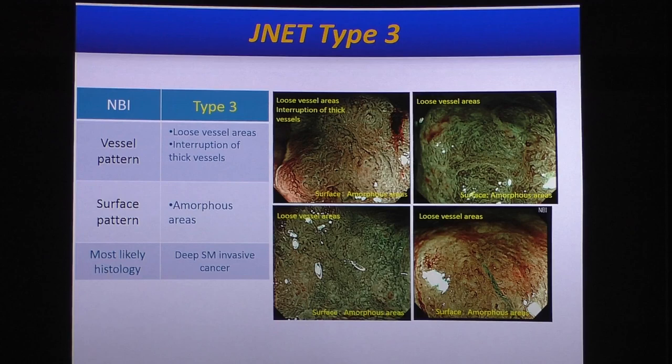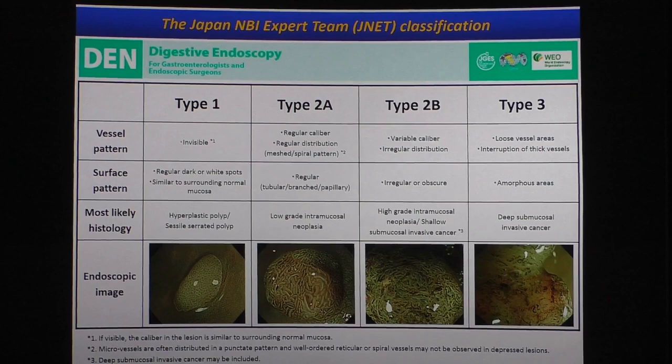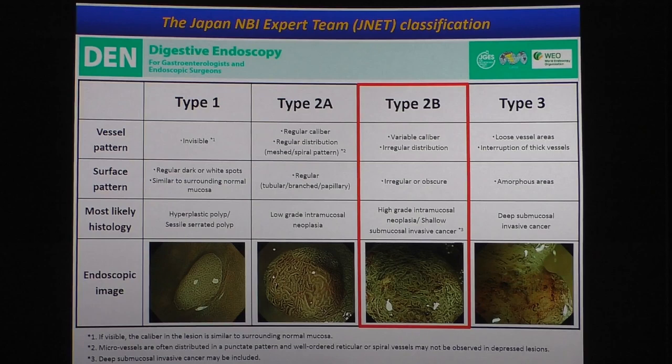Let me summarize the JNET classification. Type 1 is non-neoplastic lesion. Type 2A is low-grade intramucosal neoplasia, tubular adenoma. Type 2B includes many things: intramucosal neoplastic lesion and superficial submucosal lesion, with also a possibility of deep submucosal invasive cancer. If you see type 2B, you need to advance to magnified chromoendoscopy pit pattern diagnosis. If you see JNET type 3, the lesion is usually indicated for surgical resection.